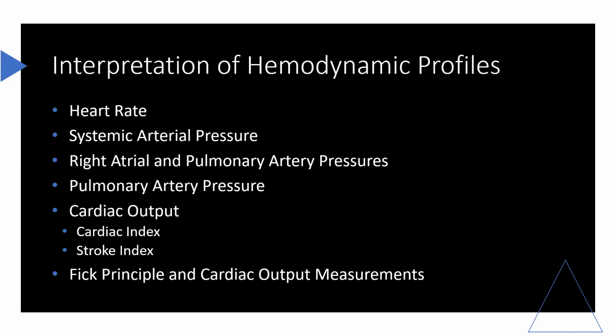The use of PEEP, either applied or inadvertent, such as auto-PEEP, at levels greater than 15 centimeters of water pressure can produce erroneously elevated pressure readings. The pressure in the thoracic circulation will rise when using PEEP therapy because of compression of the vessels by the increased lung volumes.